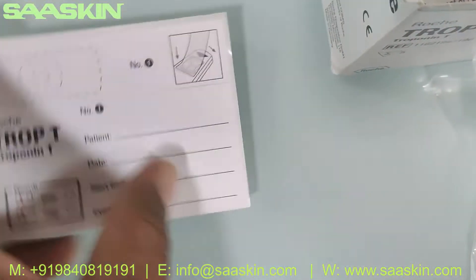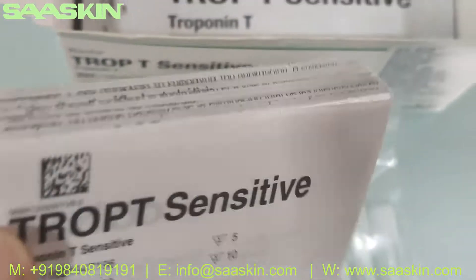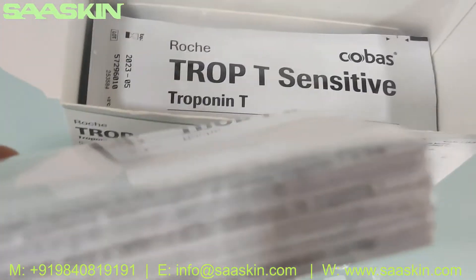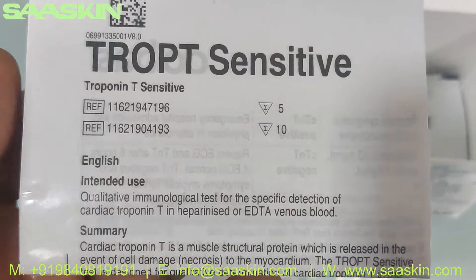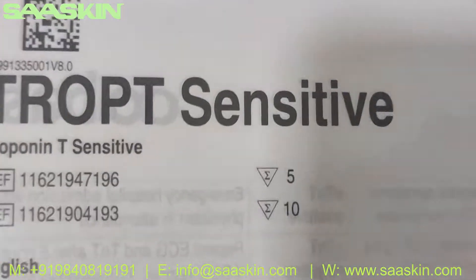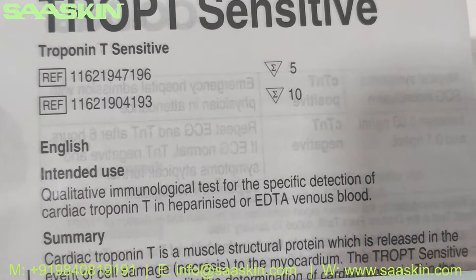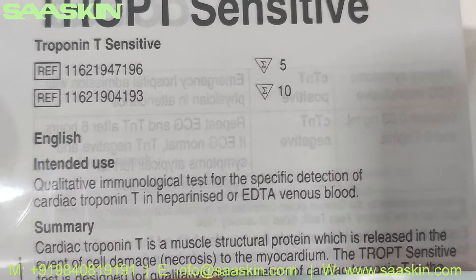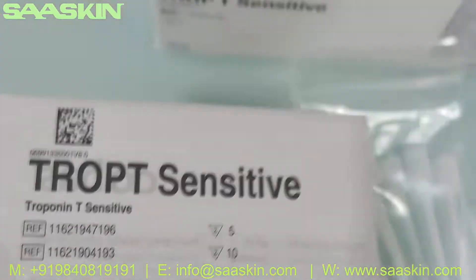You also get a brochure set — a completely sealed brochure, which is the IFU (Instructions for Use) brochure. It gives you complete instructions for completing this test. As it states, the intended use is a qualitative immunological test for the specific detection of cardiac troponin T in heparinized or EDTA venous whole blood.